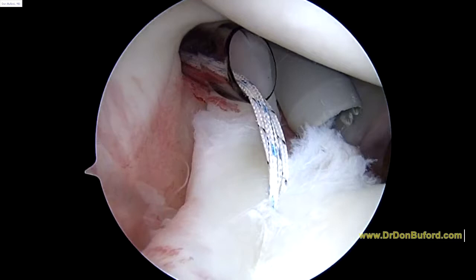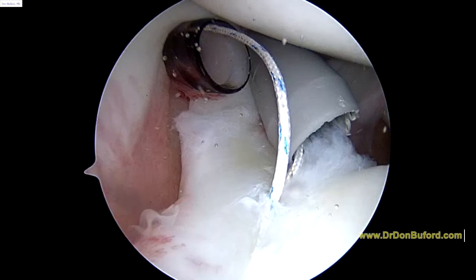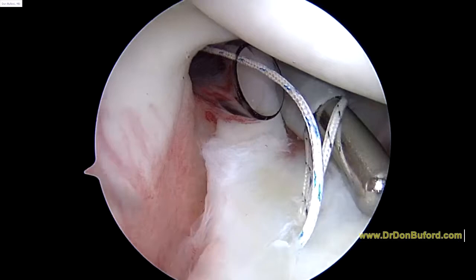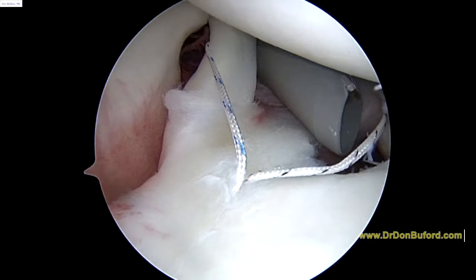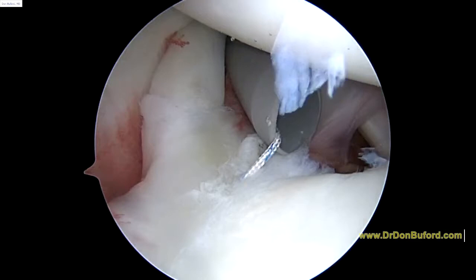So now we're going to do some suture management. We're going to take three of the sutures out of the anterior inferior cannula — just like this — take a switching stick. Now we'll take the one suture that we're going to use first, so it's inside this cannula, just like that. So that's how we're organized right now.